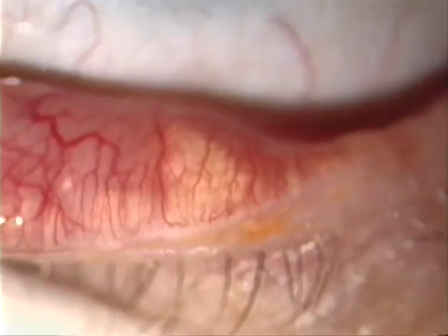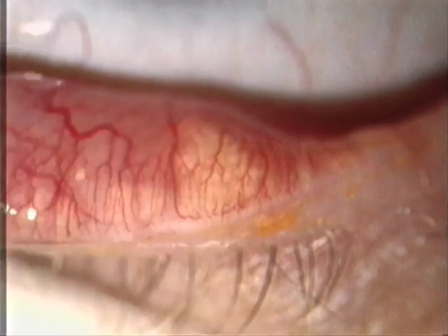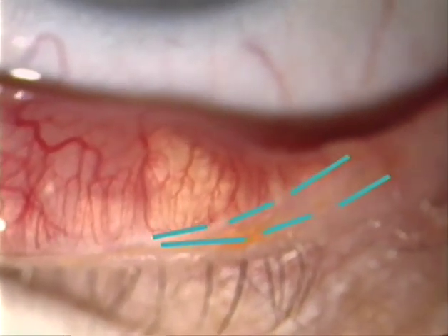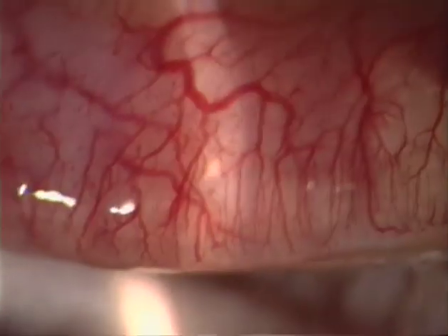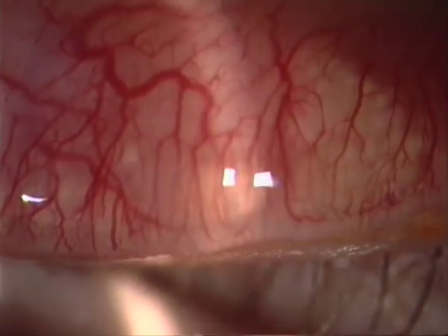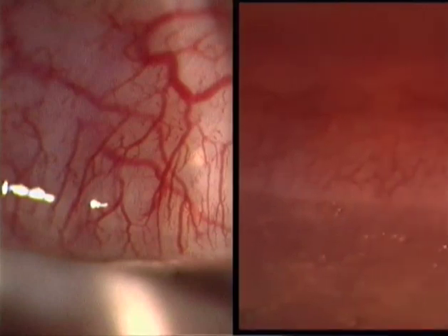But when we compare this lid margin with a normal one, we notice it to consist of cicatricial tissue, and the typical features of a normal lid margin are missing. The conjunctival vessels show the characteristics of the large vessels in the orbital conjunctiva, whereas the capillaries normally present at the lid margin are lacking.